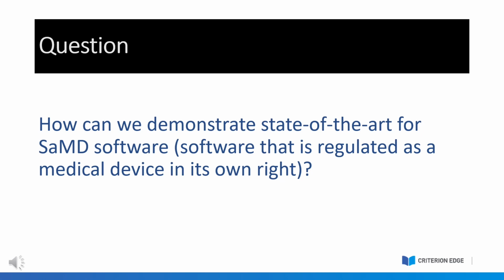So if we're considering this an SAMD, software that is regulated as a medical device in its own right, then we can demonstrate state of the art by looking at comparator softwares that are trying to achieve the same intended medical purpose.